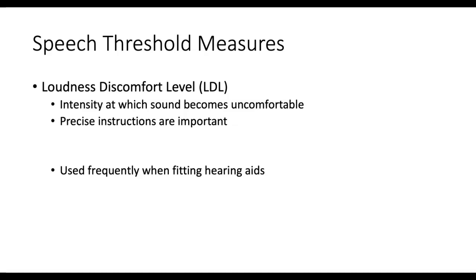Now, if you're going to fit hearing aids on an individual, you need to have an idea of what's the loudest sound by frequency this patient can tolerate, because when you set the hearing aids, you want to try to avoid exceeding this uncomfortable level. Okay, otherwise they won't wear their hearing aids. All right.